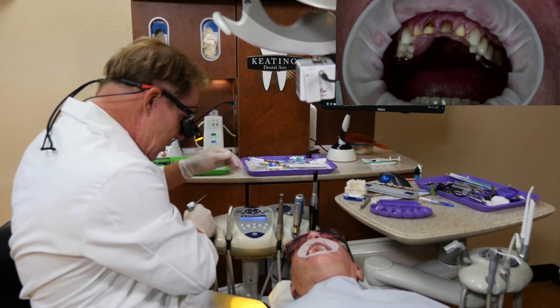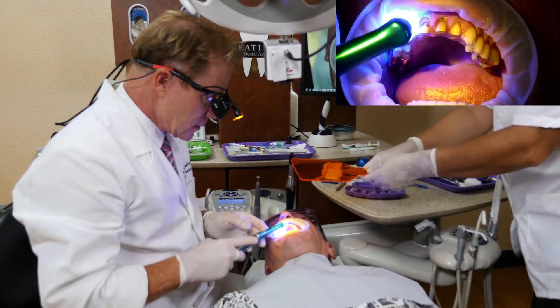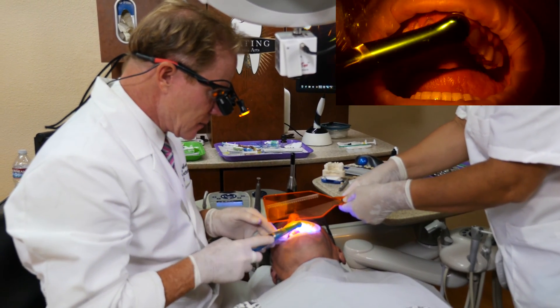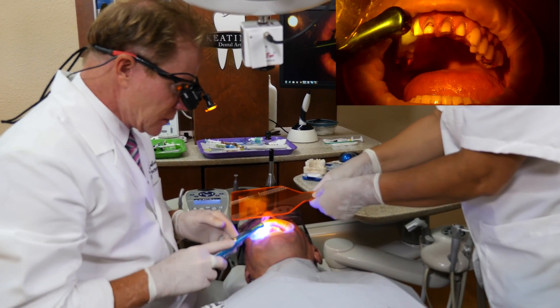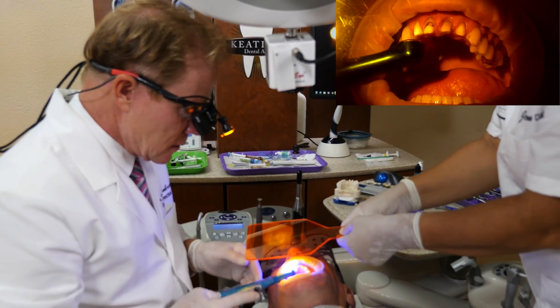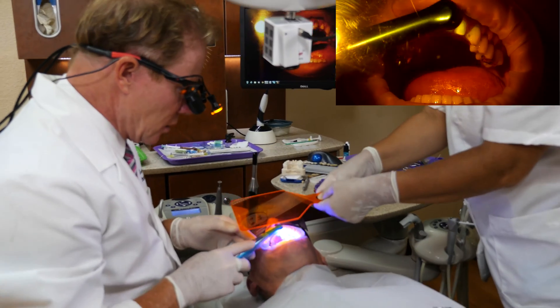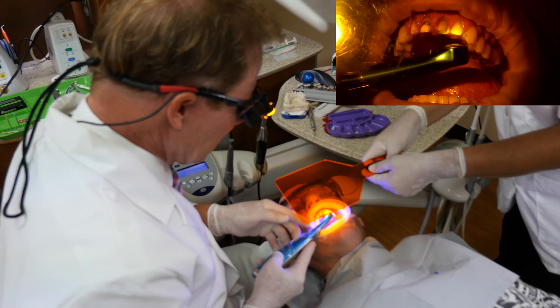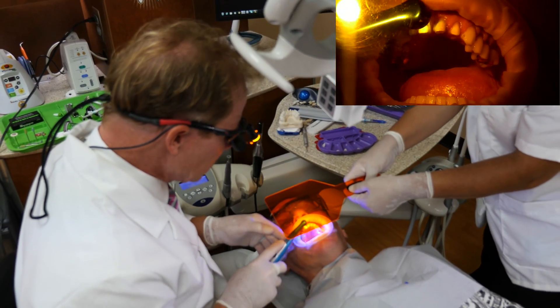Then we're going to go ahead and light cure that. We'll do about 10 to 15 seconds per tooth. This is the VALO — V-A-L-O — cordless light from Ultradent. Very, very nice light. Multiple wavelength LEDs, so it will cure everything in your practice, which is nice. A lot of the LEDs will not.